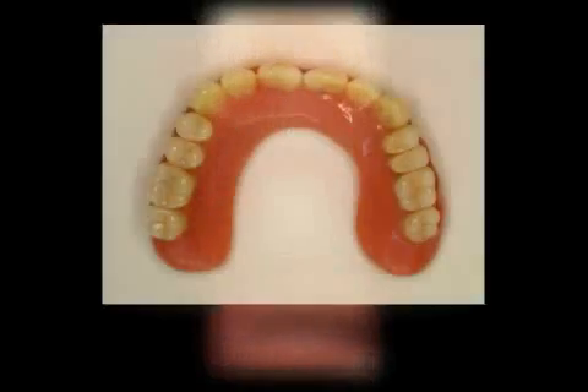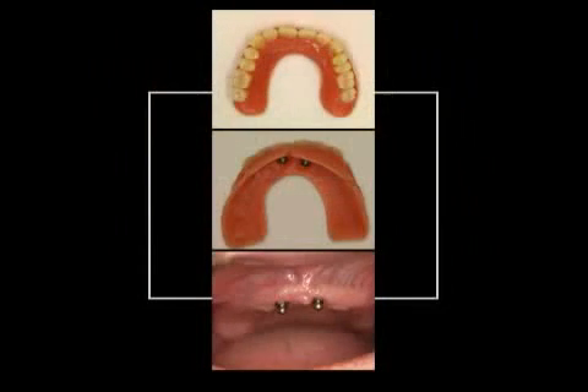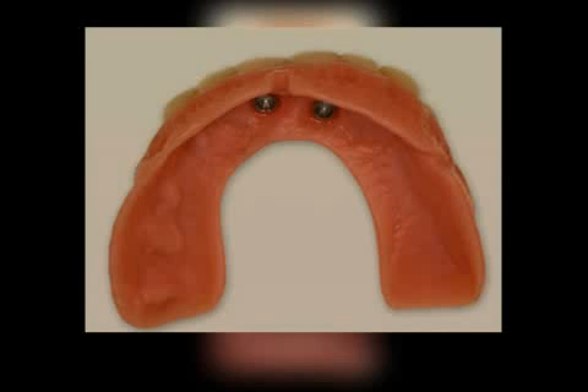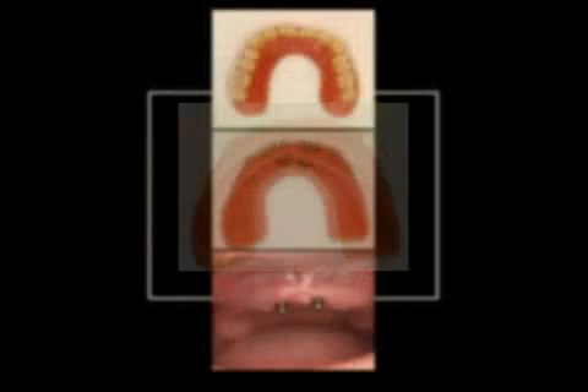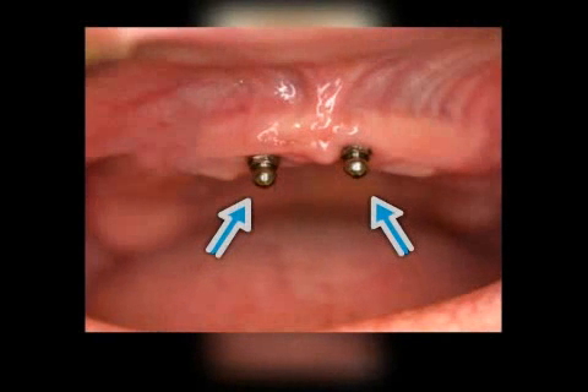In the top picture, you see an upper jaw hybrid prosthesis from the perspective of the outside. Below, you see the prosthetic base. Clearly visible in our image are the incorporated holding elements called patrus. The opposite element, called matris, can be attached to both a tooth and an implant. In the bottom picture, you can see two matrices in the upper jaw, attached to two implants in this case.